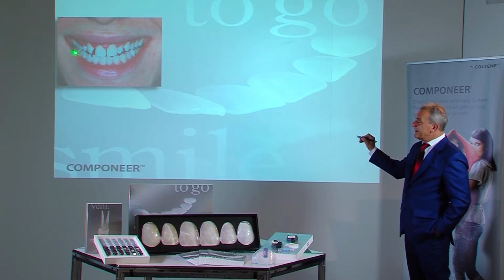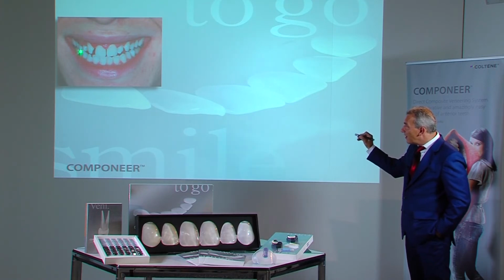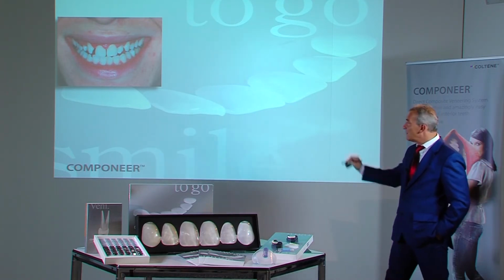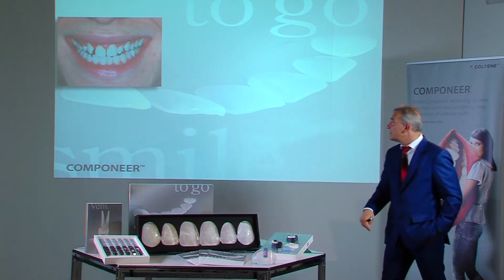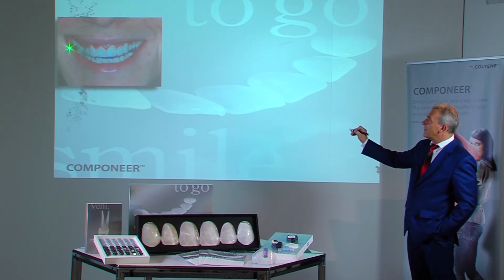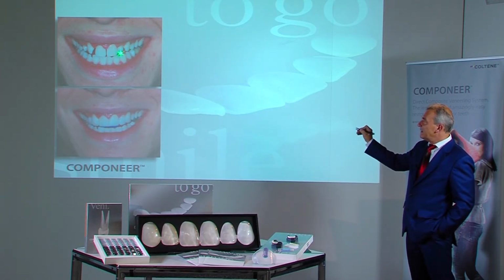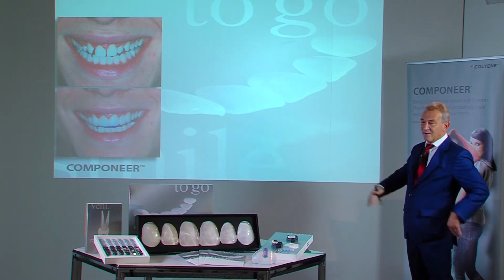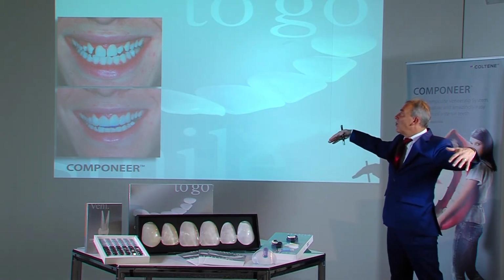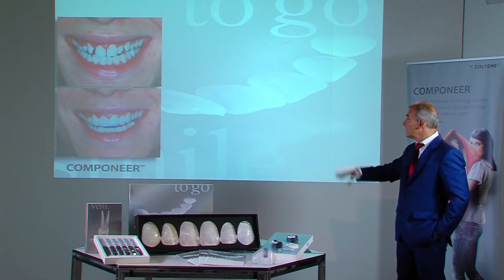In this example too, the massive contrast line as well as the gaps which appear when laughing make things look very dark, and the gums are also slightly inflamed. One can also see that the teeth are somewhat long. If one wants to harmonize the appearance, then in the end one also needs to design the front teeth a bit shorter. Otherwise they would appear too long in relation to the occlusal line. The dental arch would then appear too round or bow-like, because the upper lip is not lowered enough as to require making a curved dental arch.